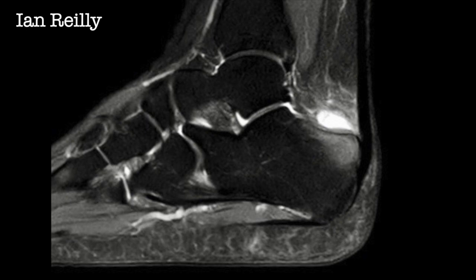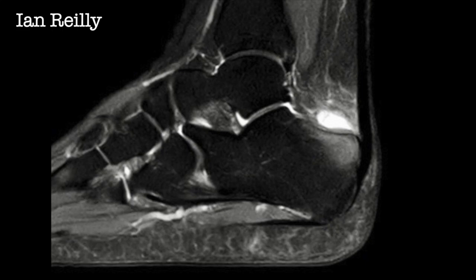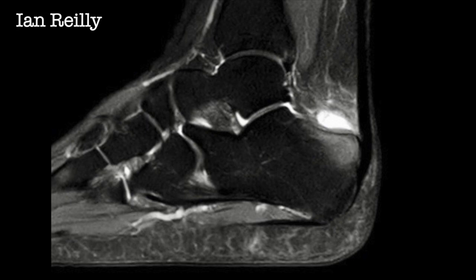It normally sits fairly high up on the back of the calcaneus, in between where the tendon inserts a little bit more inferiorly. In the MRI that you can see here, there's a lot of florid extra swelling of the bursa, as well as quite a lot of bone edema and bruising as well.